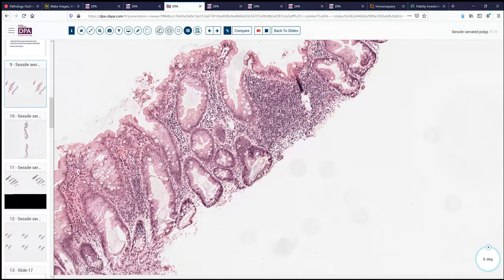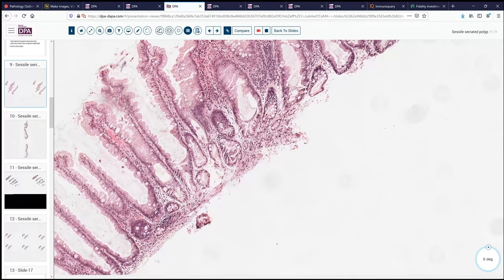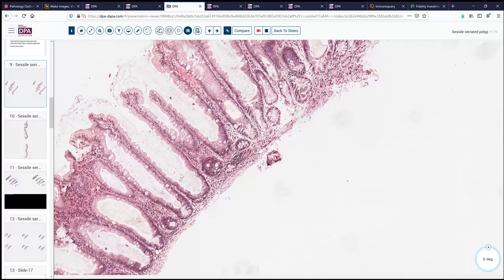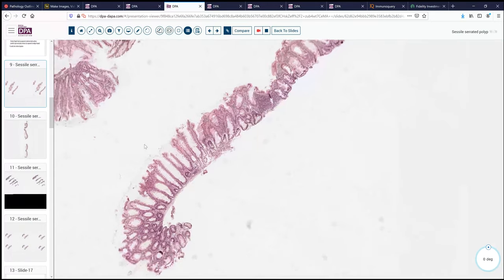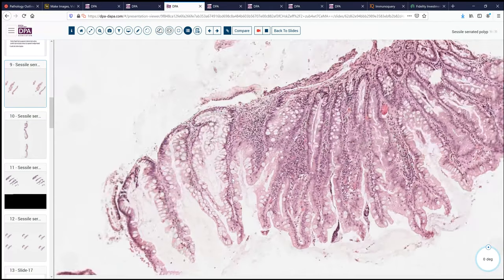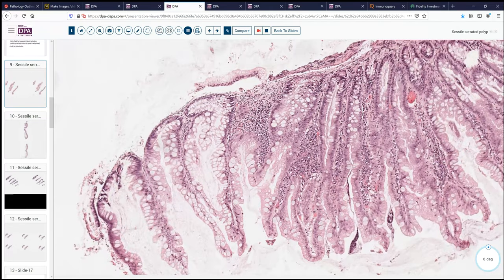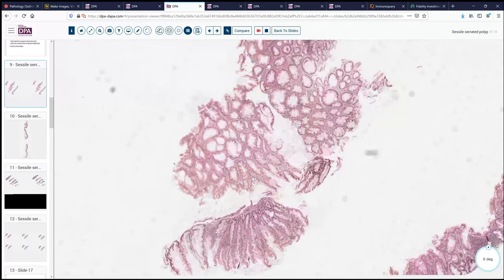Here's one gland that's pointed, but just a few doors down we see almost uniform dilatation from top to bottom — characteristic of a serrated lesion. Looking at other areas in this polyp, we can see the boot shape with the toes sticking out to one side. When these come together, we refer to it as Charlie Chaplin feet. Sometimes our orientation is a little bit challenging — for example, in this area we have a surface up here and a surface down here, and we don't know what's deep dilatation and what's superficial. Here you see the complexity of the epithelium, with a centipede-type shape in the glandular lumen.